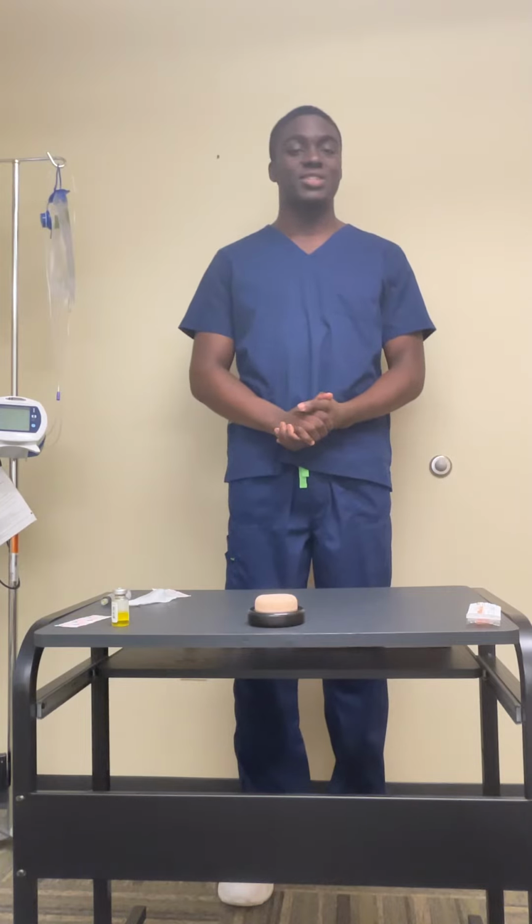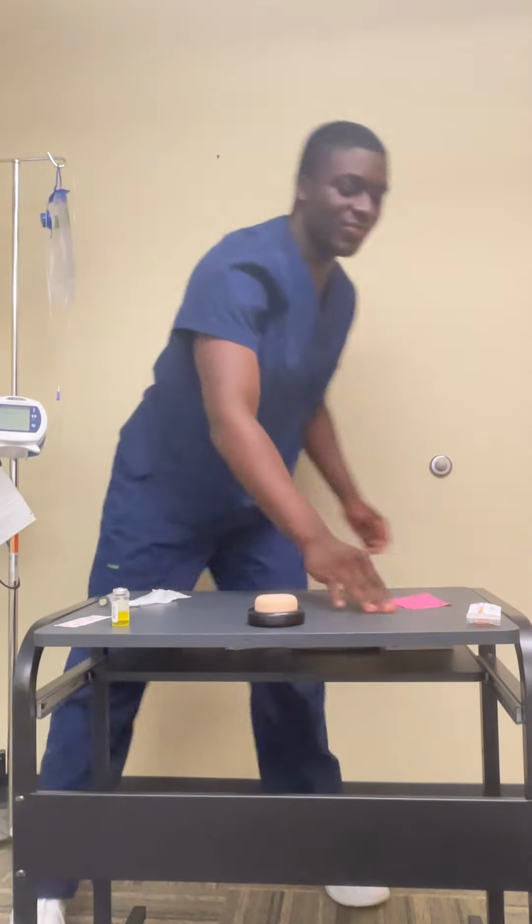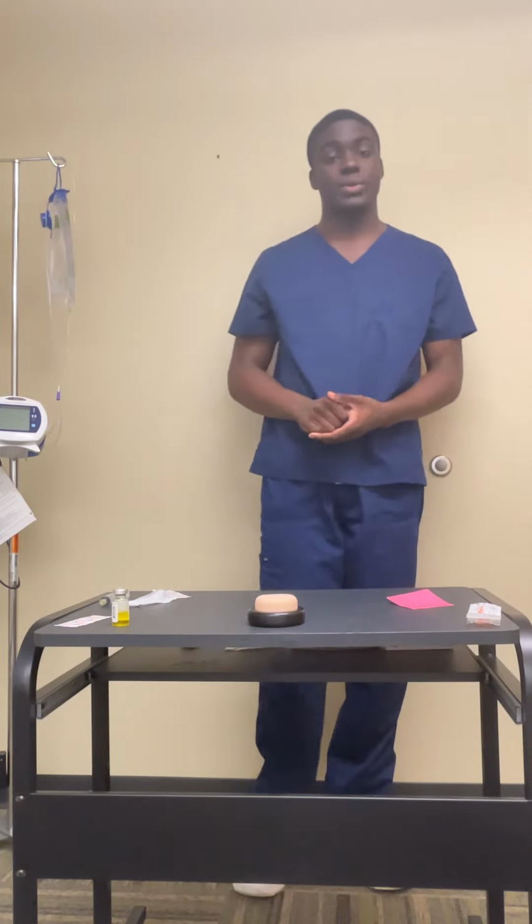Today I will be performing an intramuscular injection using the Z-Track method. First, I will look at my orders, which is vitamin K, 1 milligram over 1 milliliter, IM, Z-Track times 1 dose.